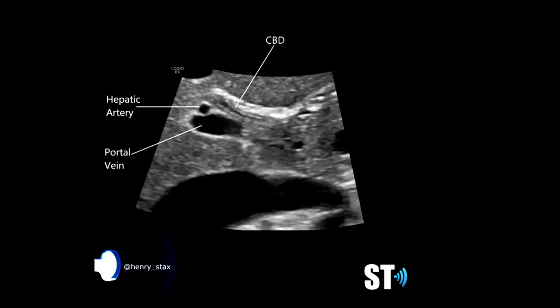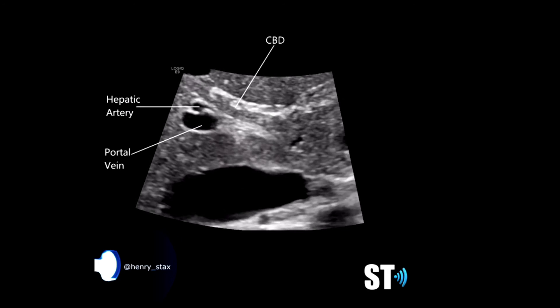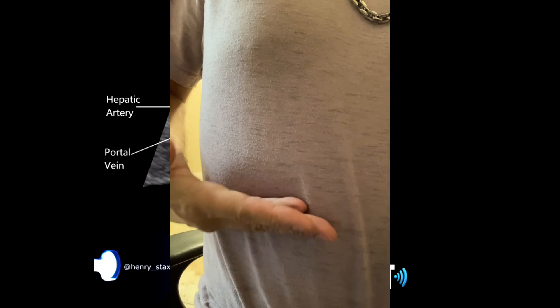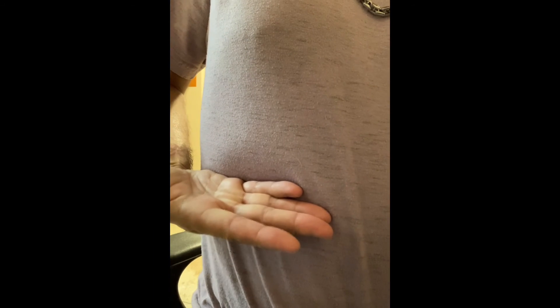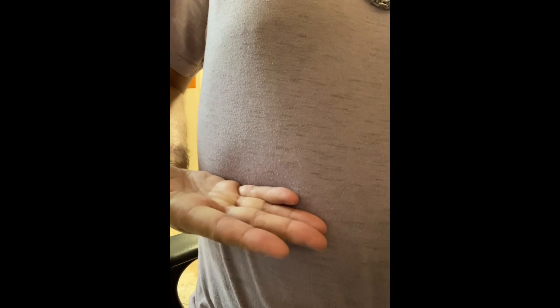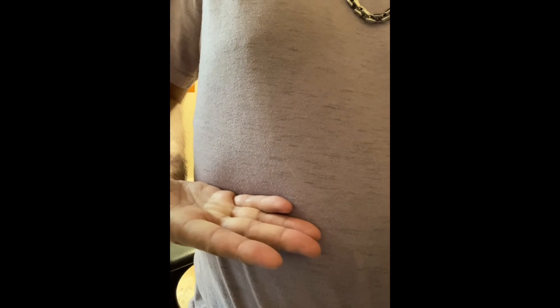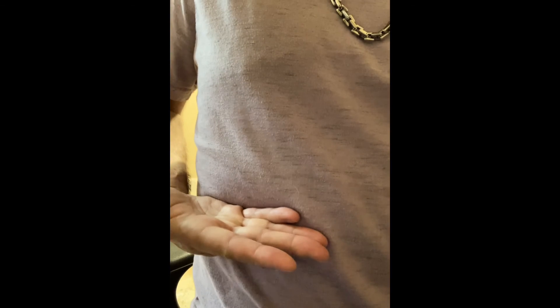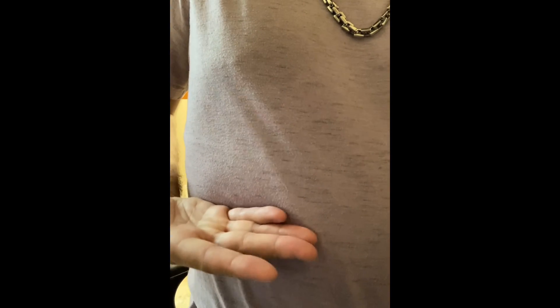If you're having trouble in this area, you can try to scan under the ribs and angle up. Have the patient take a deep breath, or you can have them exhale — but if you're going under the ribs, you're going to want them to take a deep breath.